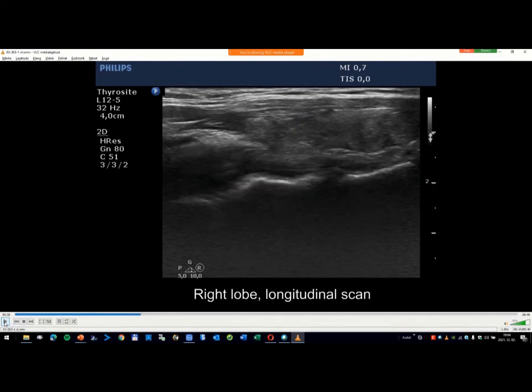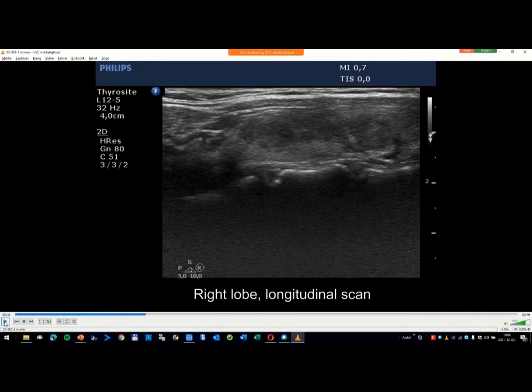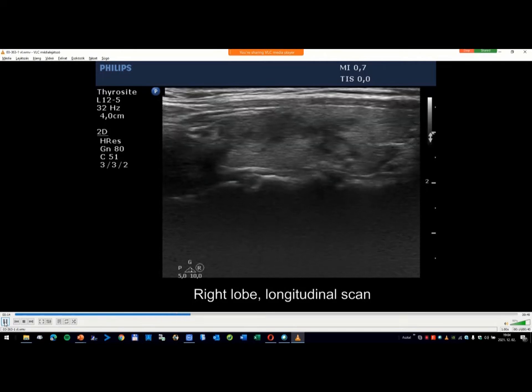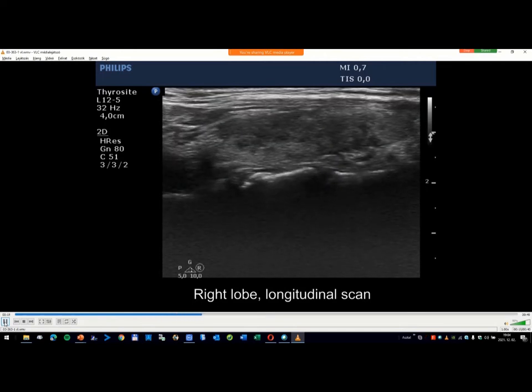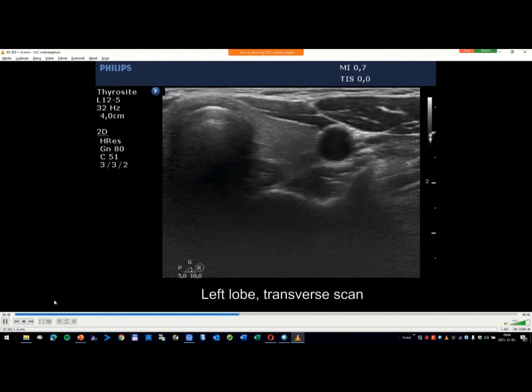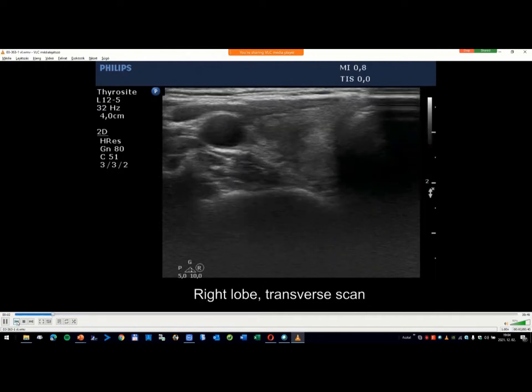Such irregular margins and lobulations should be related only to true nodules and not to fields of thyroiditis. The TIRADS system relates only to nodules and not to thyroiditis. So the classification of nodules has meaning only in the TIRADS system and not for the classification of thyroiditis. But if we misdiagnose this pattern, this would be classified as a TIRADS 5 lesion.